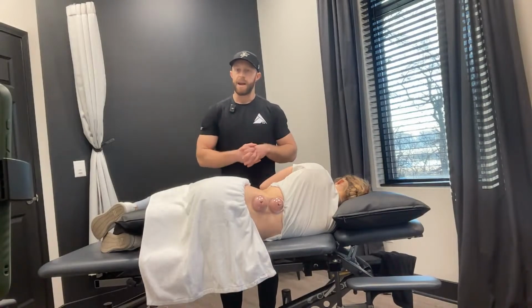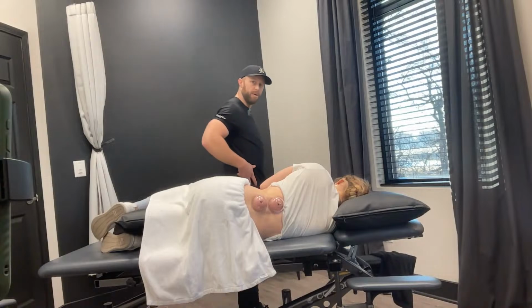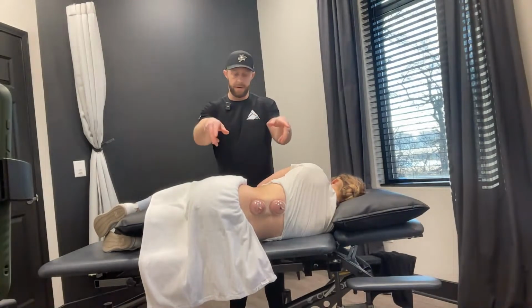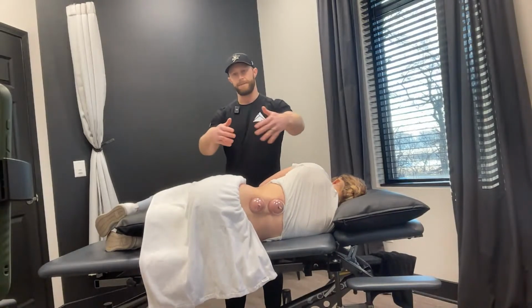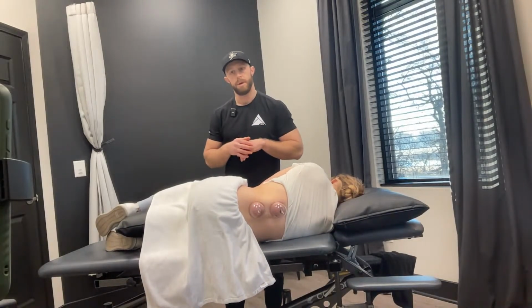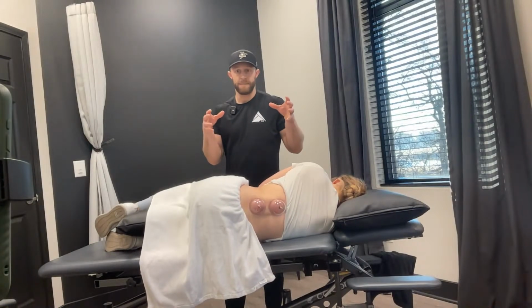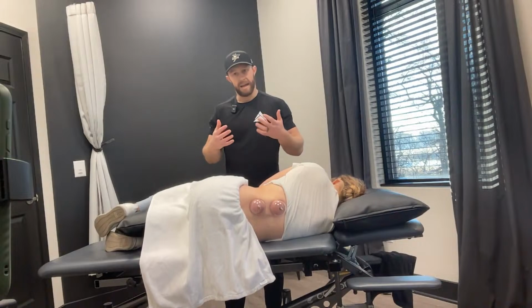But after they've sat here for a couple of minutes, I'm going to start to try to cue that person to do a bit of a posterior pelvic tilt. The point of that posterior pelvic tilt is just to access a little bit of their lumbar flexion while they're in this nice, friendly, non-weight bearing position. Anytime they're in weight bearing, that erector tends to want to be in spasm. So I'm going to get them to just relax things a little bit here and sideline in a nice, comfortable position.